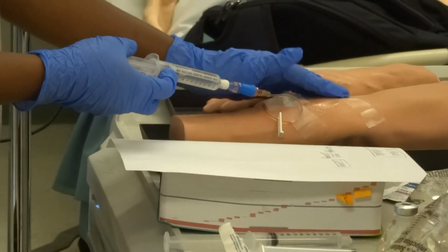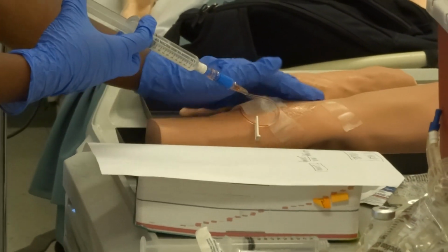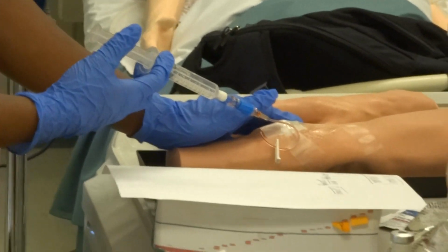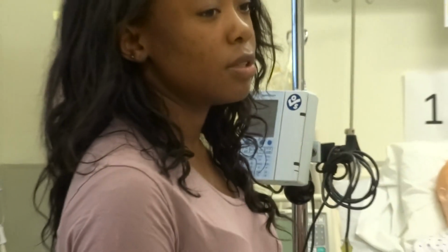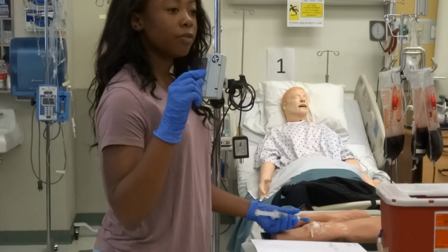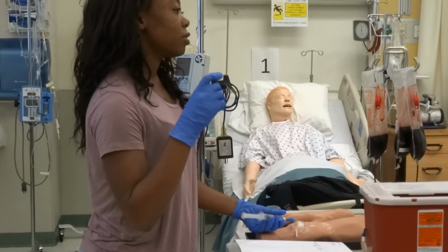So I'm just letting the patient know that I'm checking their IV, I'm looking for any infiltration as I'm pushing in. Do you guys know the difference between how much you flush with a central line versus a peripheral line? No? So central lines are always pushed with 10, always. In the hospital, you may see your nurse flush or try to check for patency with just a small 5.